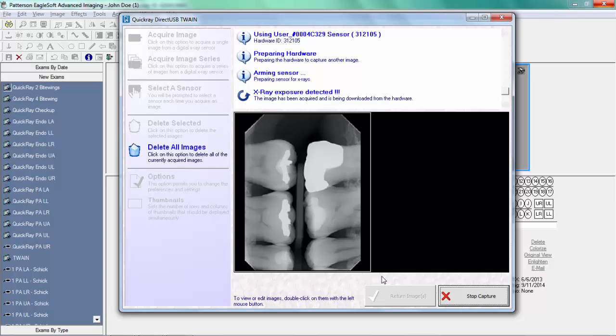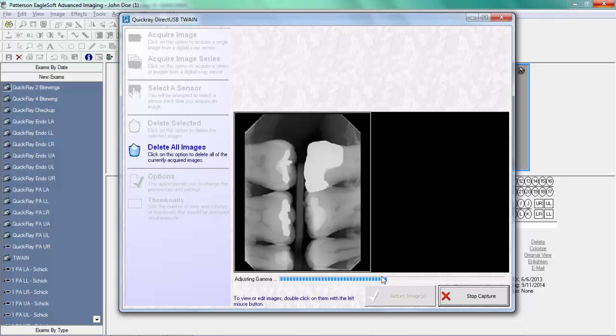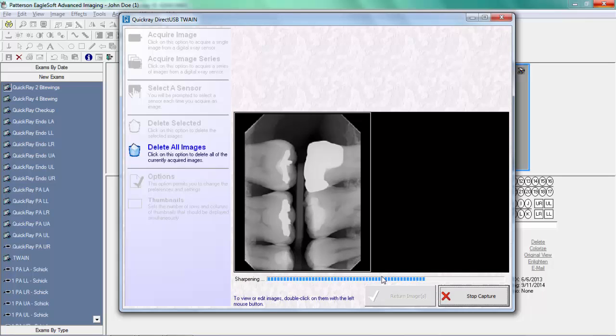The operator then repositions the sensor and captures the next image, which is displayed by QuickRay.